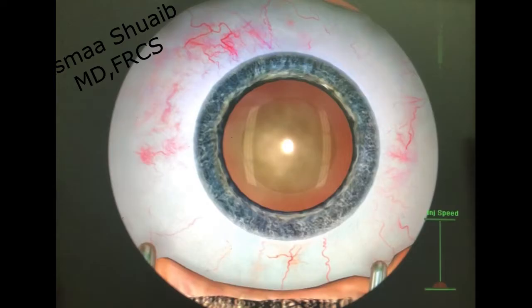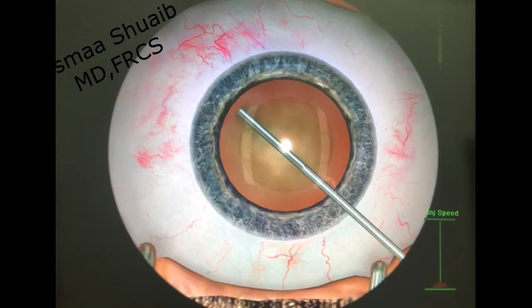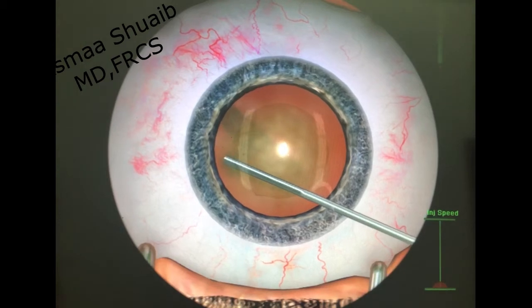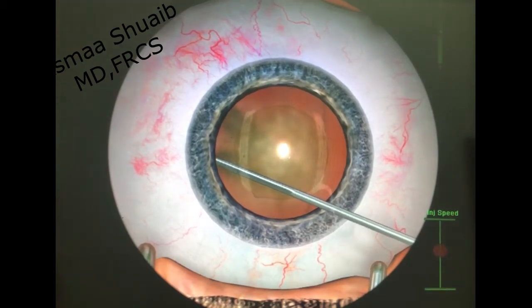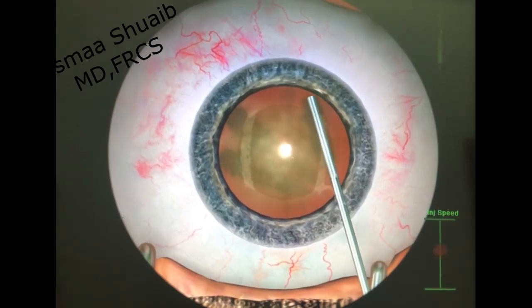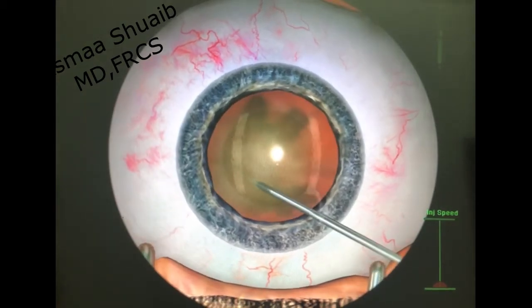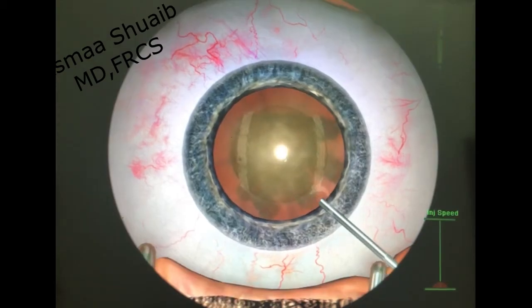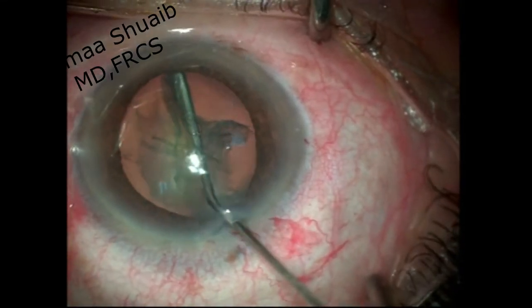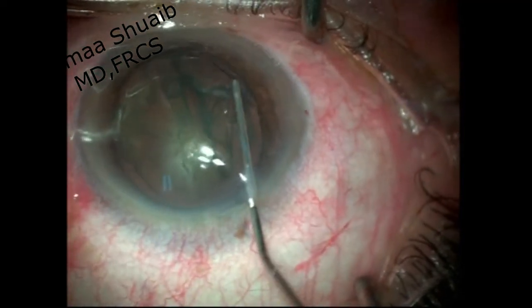And if the maneuver is not complete from the first point, just make the hydrodissection at different points until you can notice the presence of a complete posterior wave of fluid. Let's watch that in real life. At the first point of hydrodissection, the wave was not complete, so the hydrodissection was repeated at different points.